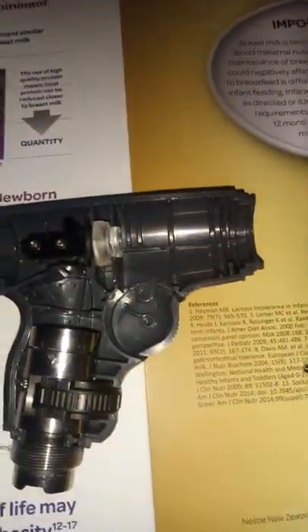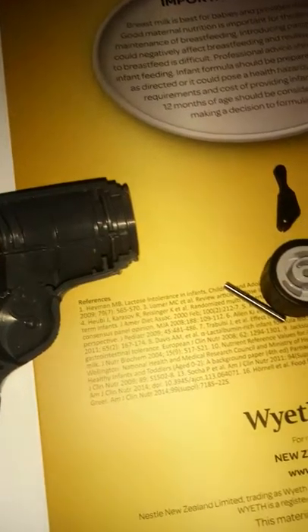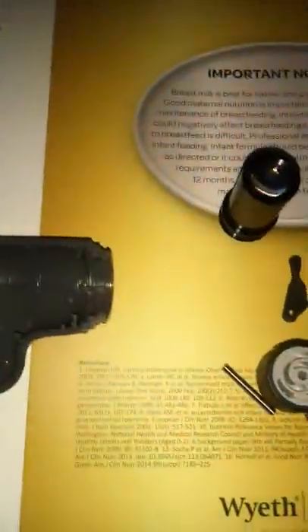this is the assembly. I guess I'll pull it apart just so you can see all the pieces. Sorry about my camera work. I don't normally make videos, and I'm just doing this with my cell phone.